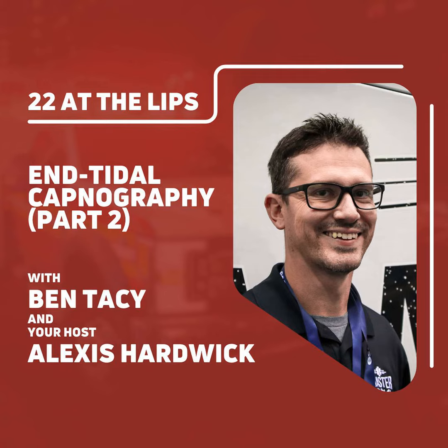Like the old colorimetric devices. Barney's bad, Big Bird's good. It changed colors, and yeah, cool, that just is the confirmation tool. Those things are junk. If you have those, throw them away. It's 2023. It's time to use technology. If you got those, trash them. Anytime I see them, I immediately throw them in the dumpsters. Biggest piece of garbage on the ambulance. Okay, so throw them in the trash. Use your technology. Great stuff.